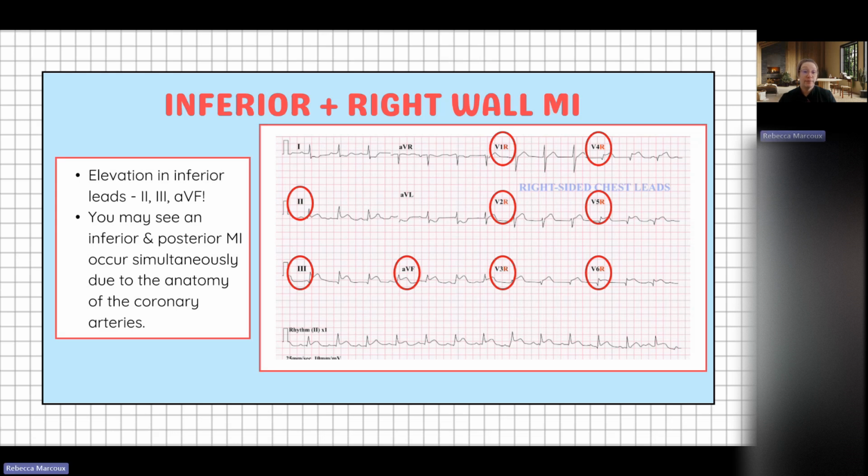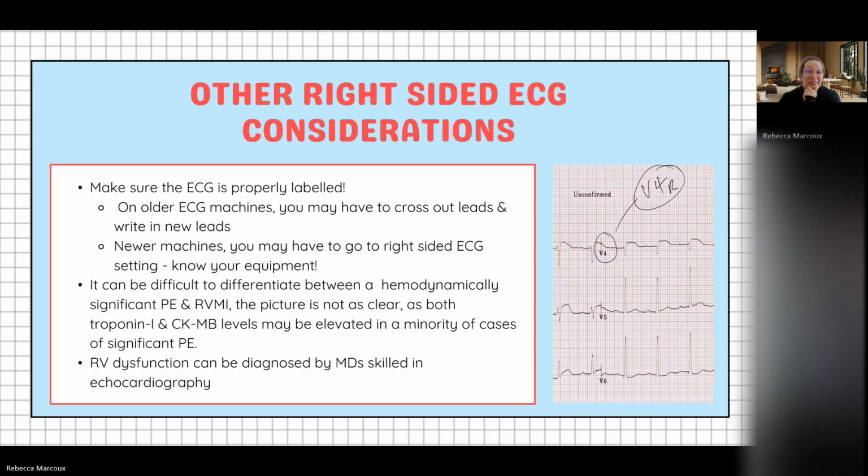Go ahead, Rachel. I have a stupid question. No, go ahead. I never tried to put the leads on the right side. Does it require a special ECG machine? Because I know sometimes we put a sticker in a little bit of the wrong place and some ECG machines don't recognize it. Do we not require a special ECG machine, or is it just the leads on the right side? Yeah, totally fair. Not a stupid question at all.